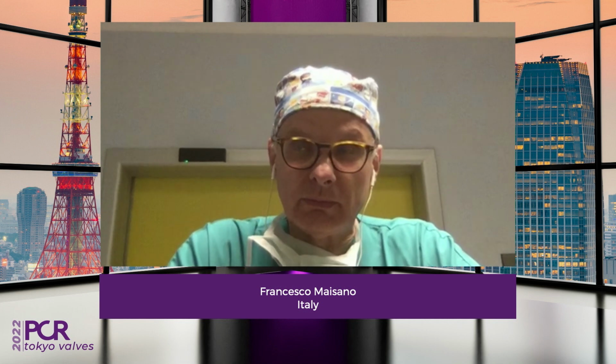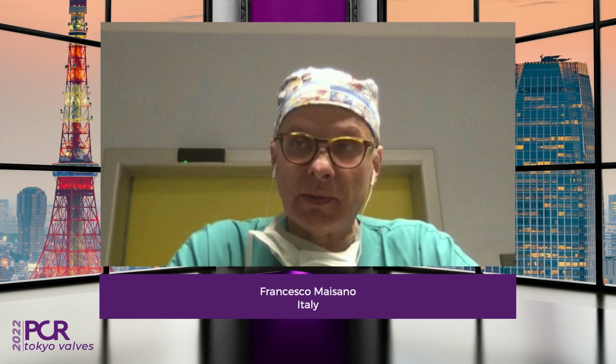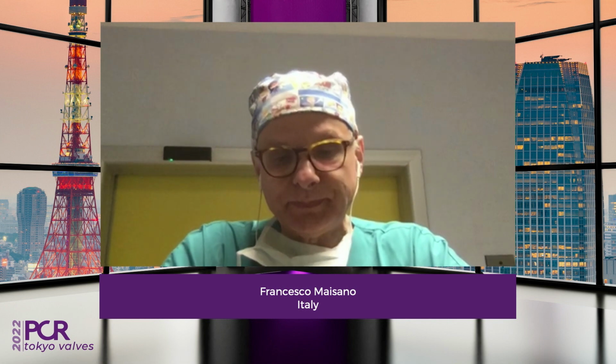So what we do during the procedure to optimize coaptation, you can use inotropic support. I like it a lot. You can put the patient in anti-Trendelenburg position. You can reduce venous return by using some PEEP on the ventilator. So there are many potential tricks to reduce, at least temporarily, the venous return and improve coaptation.